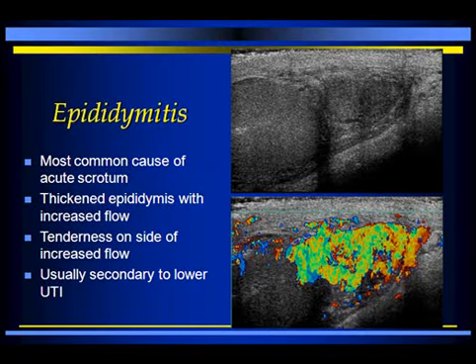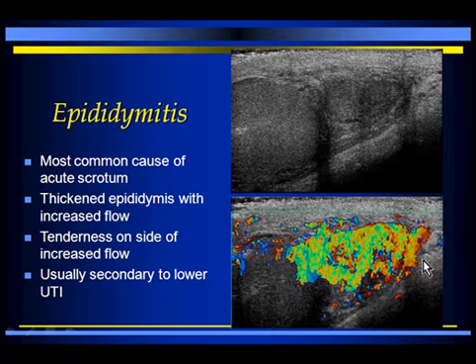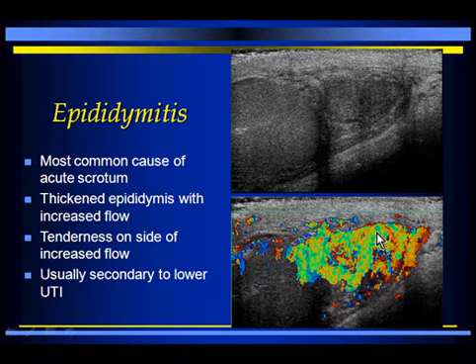So let's move a little bit now towards the evaluation of the tender testis. Scrotal pain is probably one of the most common complaints that people come in for, where we do ultrasound of the testis, especially young men. Epididymitis is perhaps the most common cause of acute scrotum.